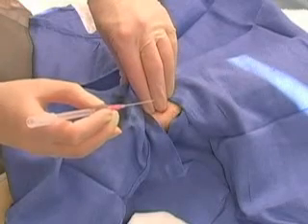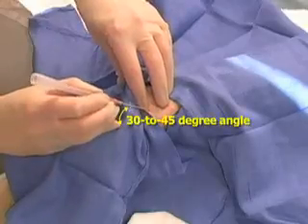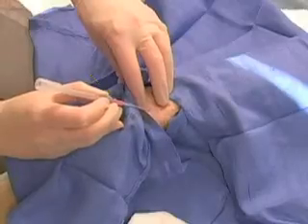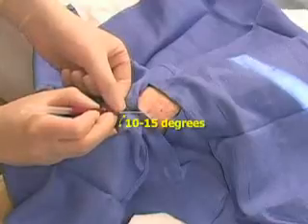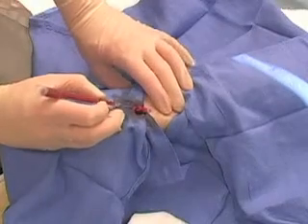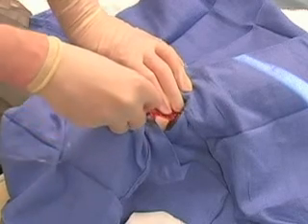In the over-the-needle technique, an angiocath is used and advanced at a similar 30 to 45-degree angle. Once blood return is obtained, the needle is advanced slightly farther to assure that the catheter has entered the vessel. The needle angle is then lowered to 10 to 15 degrees, and the catheter is advanced into the vessel. Proximal pressure is applied to the artery, and the needle can then be removed, and the catheter can be connected to the transducer system.